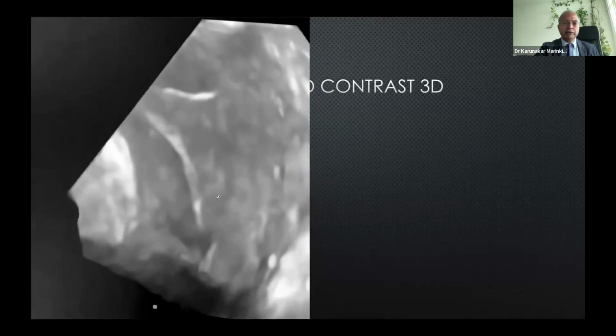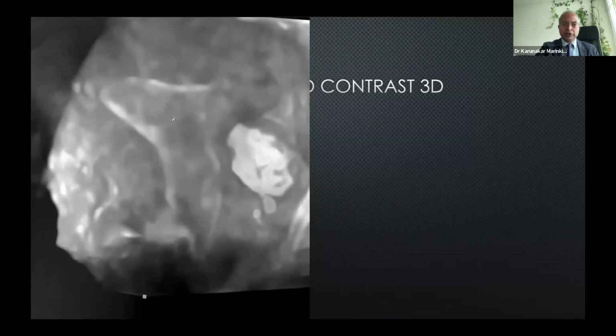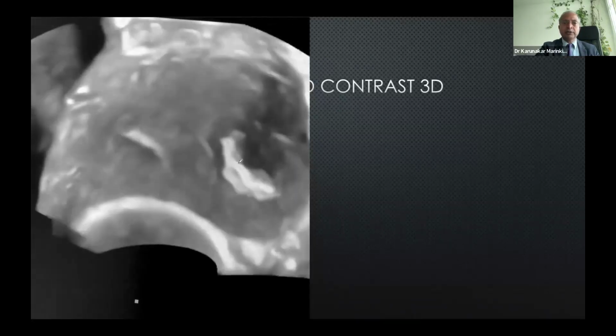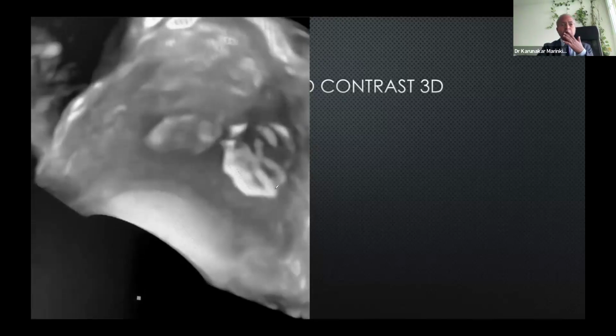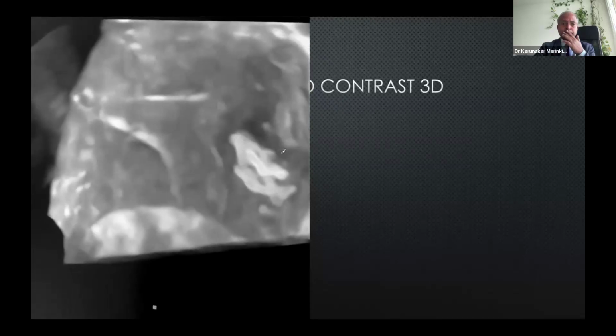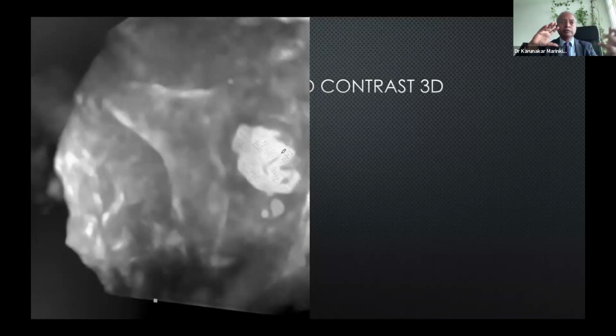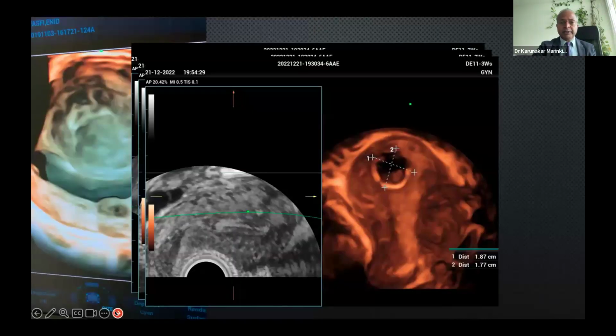So I just went to the left lateral view. I'm in the anterior posterior view. You can see a rough white outline of the endometrial chamber, and you can see the calcified fibroid in the left lateral wall of the myometrium. So we can tilt. It's like taking a baby doll. When you're practicing forceps delivery on a baby, you can turn the head into ROT, LOT, OT, OP, whatever you want to play. And 3D is nothing but you can go 360 degrees around your child and you can take any angle of the picture. Therefore, you get a better diagnosis.